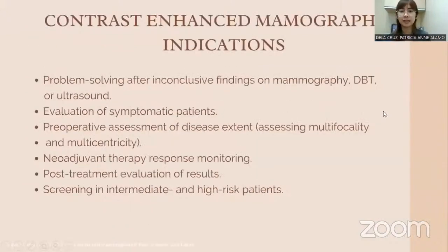The contrast-enhanced mammography indications are problem solving after inconclusive findings on mammography, digital breast tomosynthesis, or ultrasound. It can also be used for evaluation of symptomatic patients and preoperative assessment of disease extent.